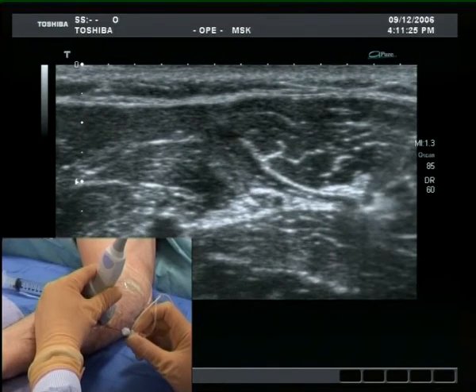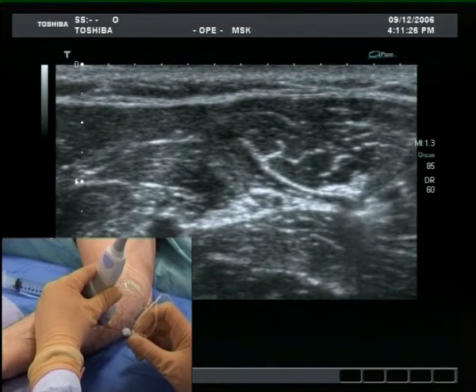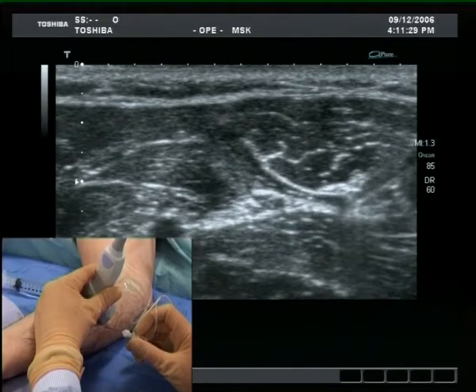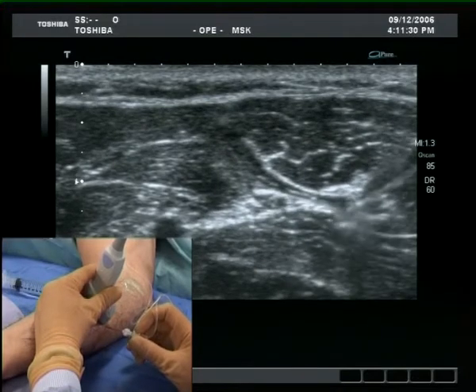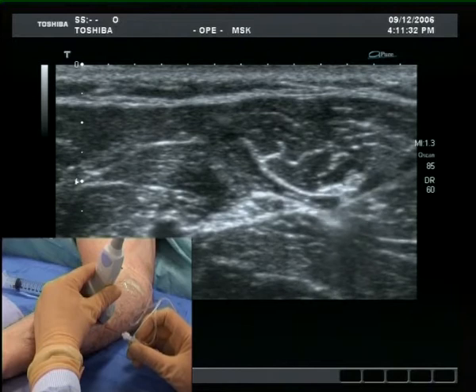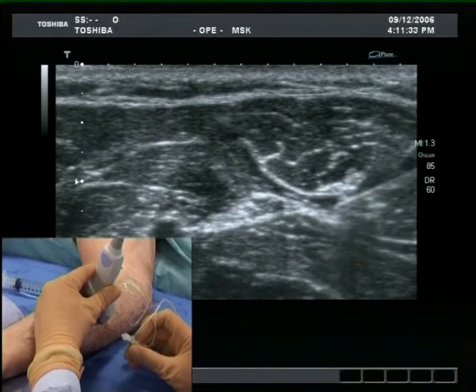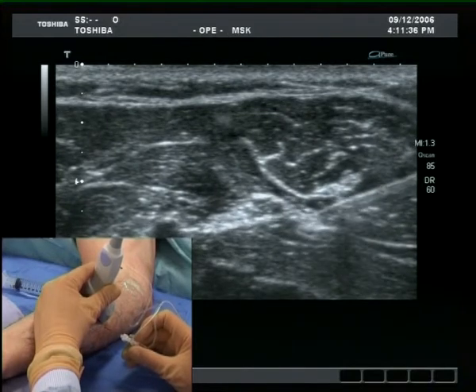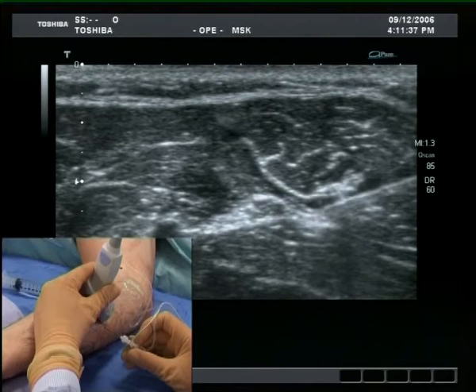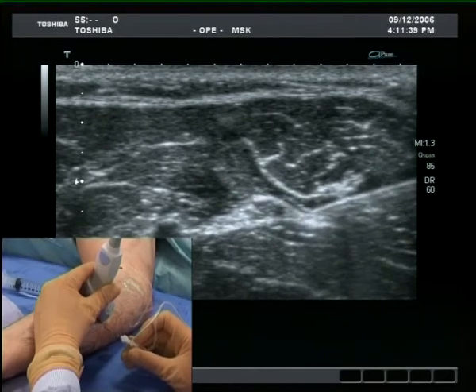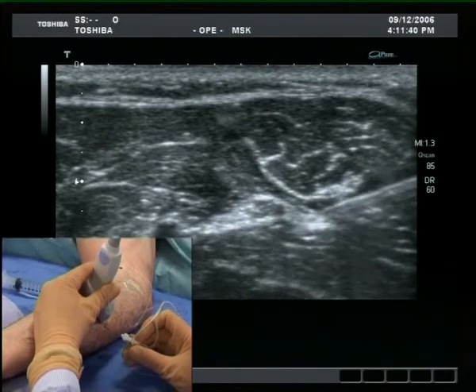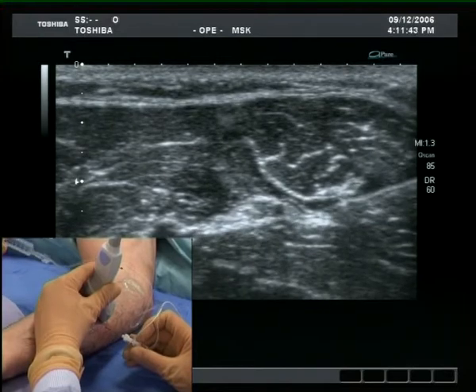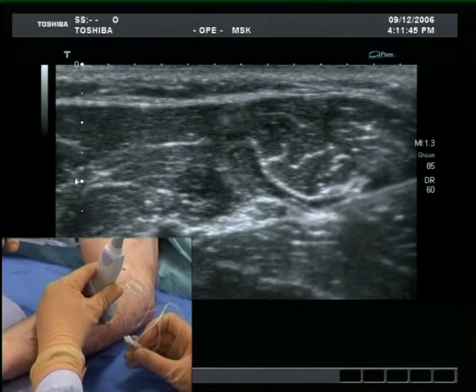The aim is to place the needle tip close to, but not touching the nerve, between the fascial layers — the white lines around the muscles of flexor carpi ulnaris and flexor digitorum profundus. Note the smallness of the hand and needle tip movements. Tiny probe angle adjustments keep optimal needle tip visibility.